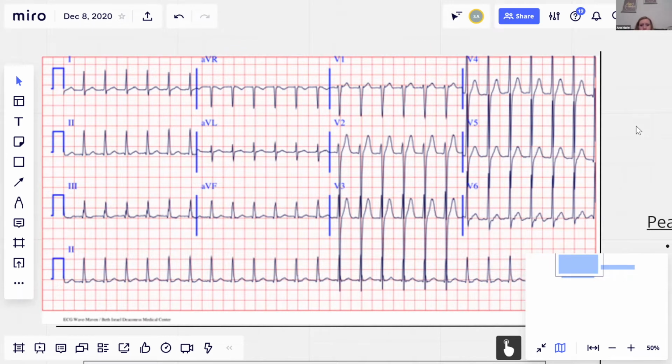And so I'm always kind of wondering about, could this be atrial flutter? And I have been fooled by atrial flutter before. I don't clearly see the sawtooth pattern or anything that I would expect in a 2-to-1 atrial flutter pattern. And then kind of the other things I'm thinking about when it's regular are, is this just sinus tachycardia? Usually I don't expect sinus tachycardia to get above about 150 to 160. So if it's a lot higher than that, it lowers my suspicion.